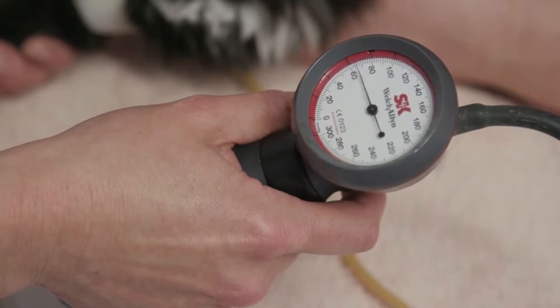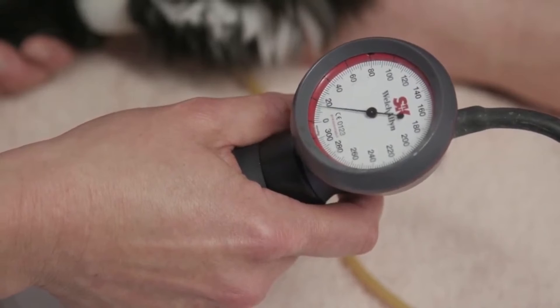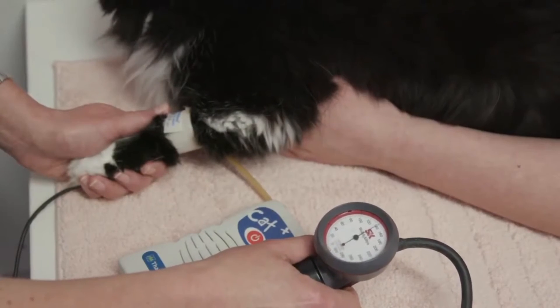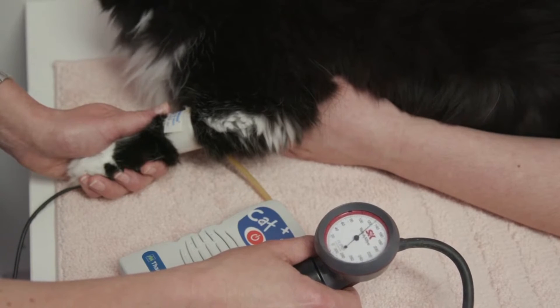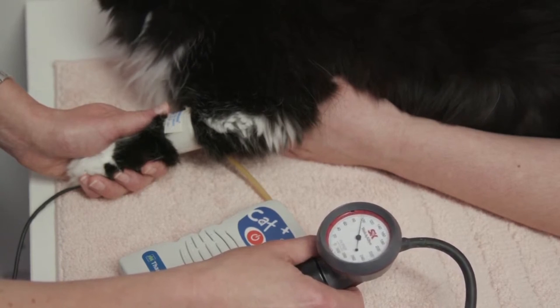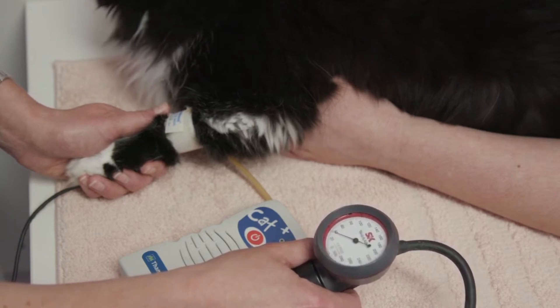Deflate the cuff completely and repeat that procedure so that you collect 3 to 5 readings which are all similar, and then you can calculate the average systolic blood pressure reading for that cat. A typical reference range for systolic blood pressure readings in the clinic is between 120 and 150 millimetres of mercury.